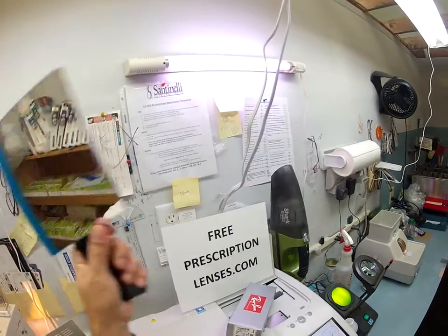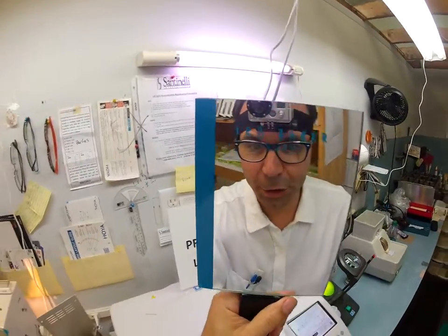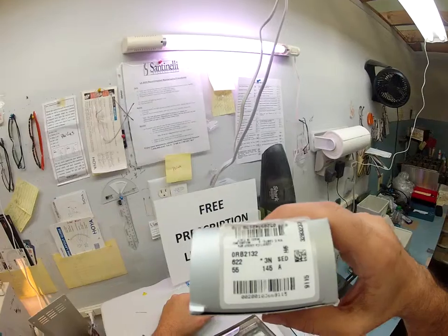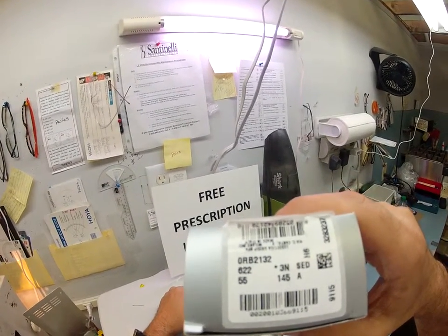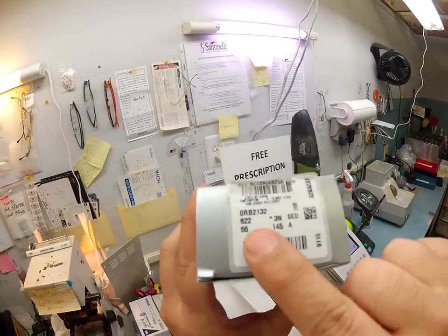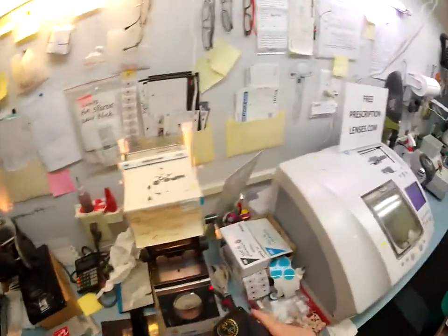Hello Mitch, this is Matthew with FreePrescriptionLenses.com and with the help of my GoPro camera, I'm going to show you how I cut your prescription lenses for your Ray-Ban 21-32, color 6-2-2, and size 55, the large. You saw me wearing the smaller 52, you are getting the larger 55, and the new Wayfarer, and the black rubber. Let's go ahead and take everything out of its original packaging.